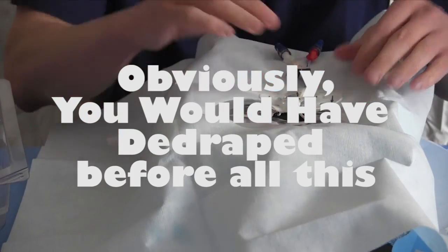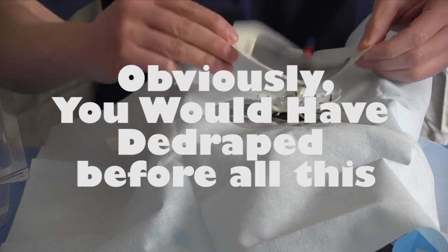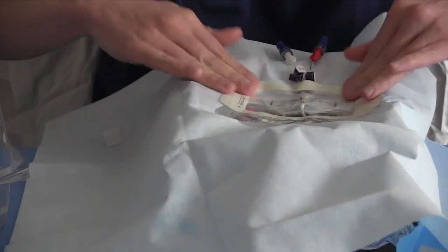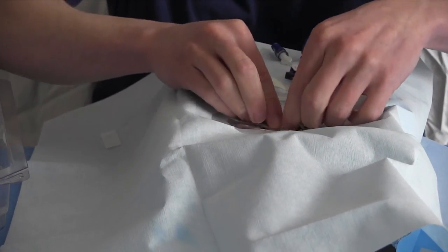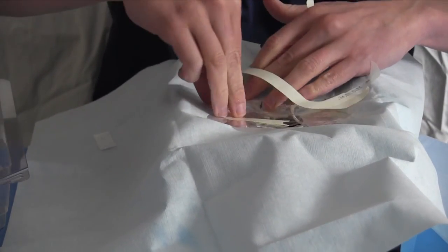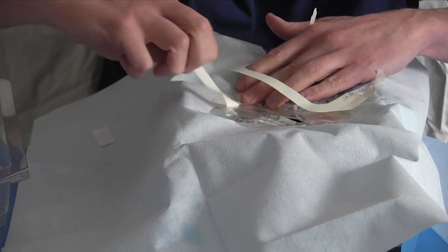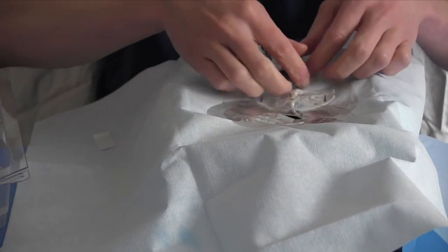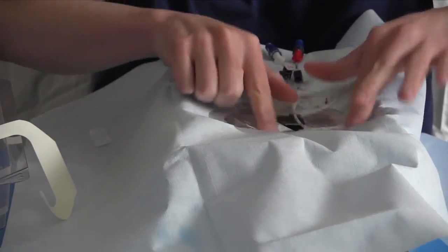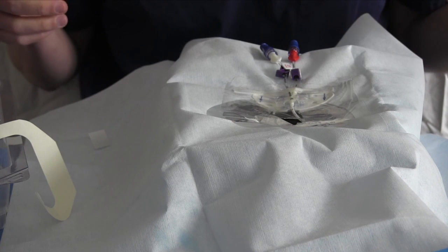So pop a BioPatch on there, and then take your Tegaderm out the whole thing, including the BioPatch. Don't get your little purple clamps in there. And if you're really good, you'll take out the little date portion. And you could time and date that bad boy. And there you go. Now, you don't need an x-ray.